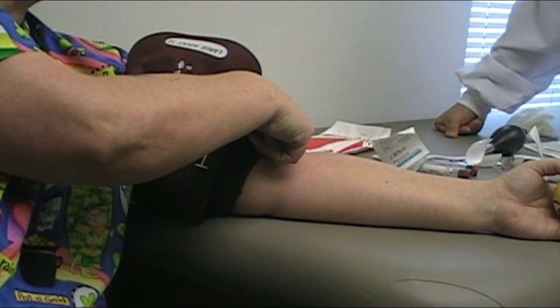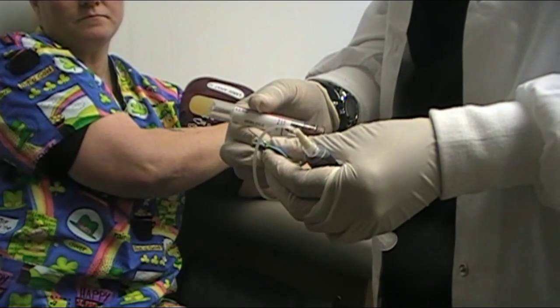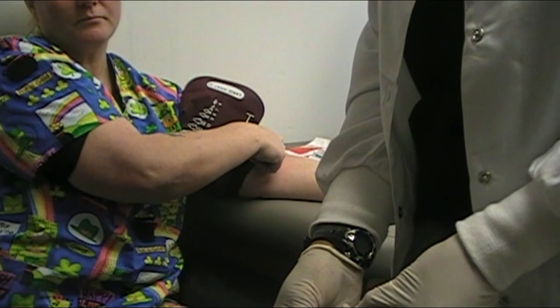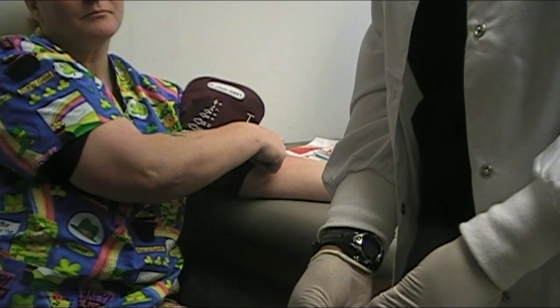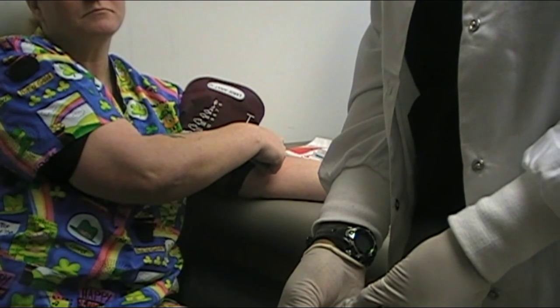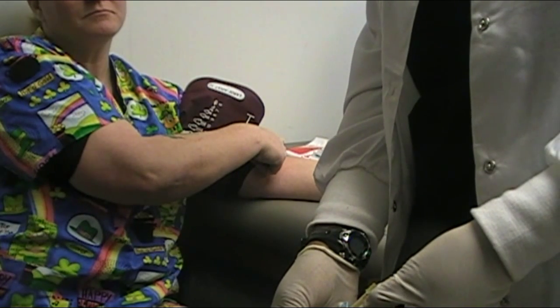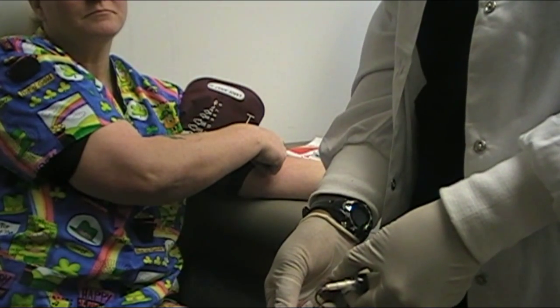The other reason is we don't want to separate the needle from the drawing apparatus ever — just throw the whole thing in the sharps container. Grab your tube, take the shield off, and hold the tube down with the stopper up. Put that in there and just let the vacuum of the tube pull the blood in, so you avoid cell destruction and hemolysis as you transfer it into an actual vacutainer tube. You don't want to exert pressure on the plunger because that will cause it. If you let the vacuum pull it in, it's just as if it was pulling it from your blood vessels. Then take your whole syringe and needle and throw it right into the biohazard container.